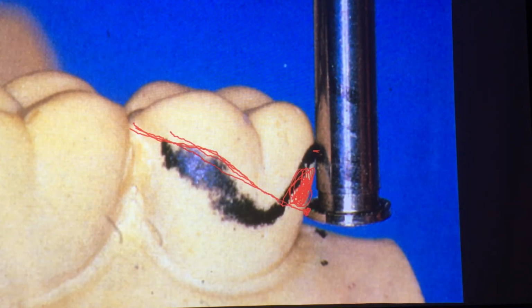Last year we had wrought wire clasps that we could maybe engage a little bit more because they're more flexible. The modulus of elasticity of an 18 gauge stainless steel wrought wire is higher. But chromium cobalt is pretty stiff, pretty rigid. So 0.25 millimeter undercut. This may not make sense to you, but once we go through the practical, it will.